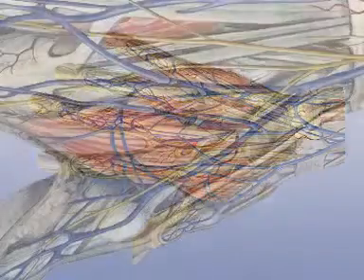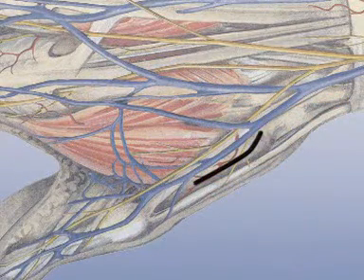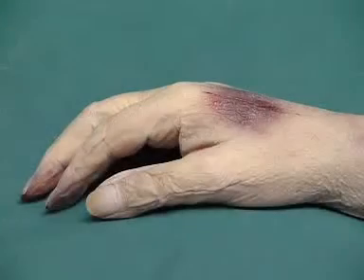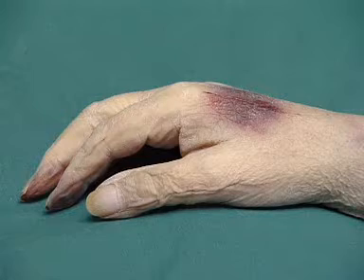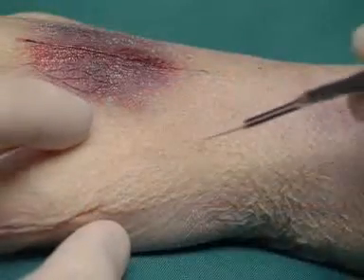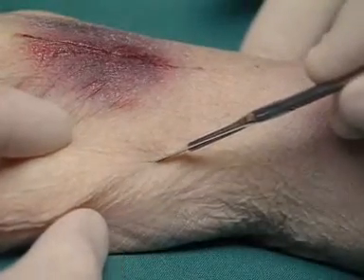The access to the base of the thumb metacarpal is dorsal, between the two extensor tendons of the thumb. The base of the thumb metacarpal can be exposed through different approaches. Here, a dorsal proximal skin incision, curved slightly in the ulnar direction, is chosen for dorsal positioning of the plate.